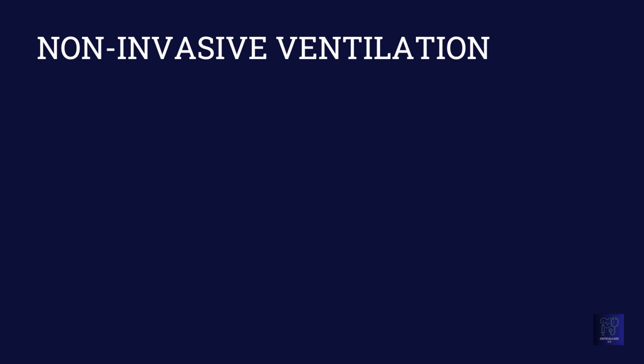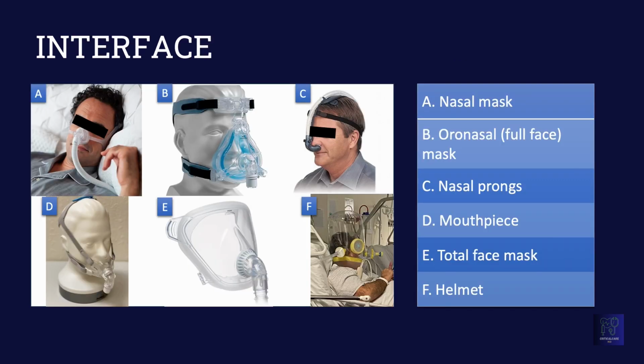Once you decide to place your patient on non-invasive ventilation, there are three important decisions you have to make. One is the interface, two, the mode, and three, the settings. Let's start with interface. Interface is basically the piece that connects to the patient.